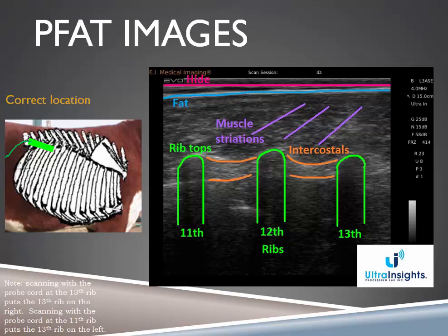Let's talk about Pfats and image quality. I use the term Pfats, but I'm talking about percent intramuscular fat. The slang term is Pfats. Again, we've got our steer, the proper probe placement. This is the cord. If you want to push pause and read this, you can. And we've got a properly collected Pfat with the landmarks overlaid on the right side of the screen.